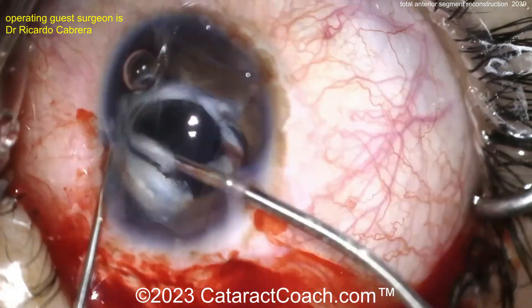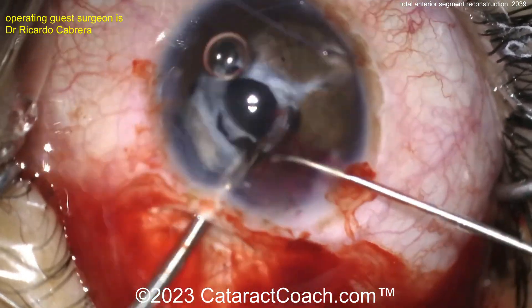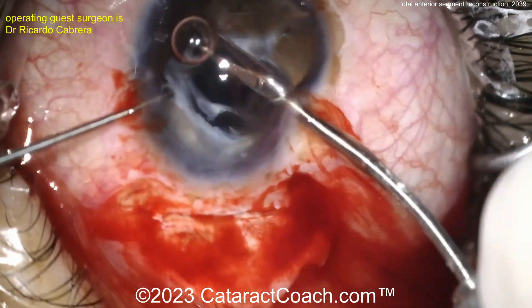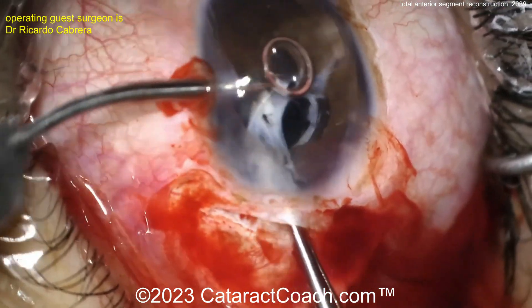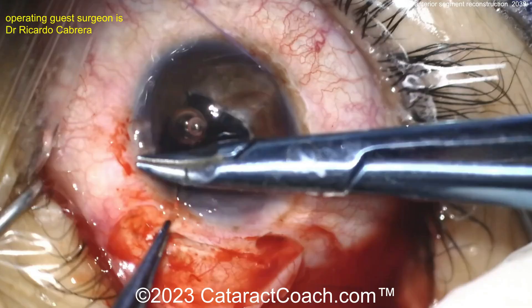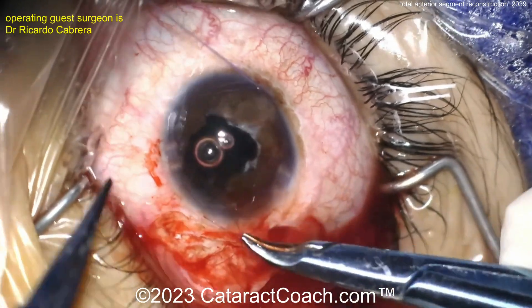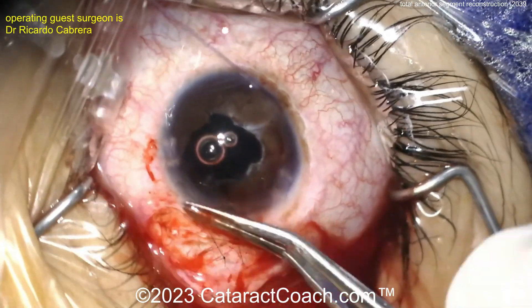Viscoelastic is your friend. There's the lens — make sure it's not attached to anything. I like the use of the micro scissors there to cut any attachments; maybe there's some zonule still attached. Cut all that to make sure the eye wall is free — you don't want to put any traction on other parts of the eye. Got the lens out. That looks tough. Going to need a pupilloplasty for sure. 10-0 nylon to suture up the main incision, the sclerotomy.